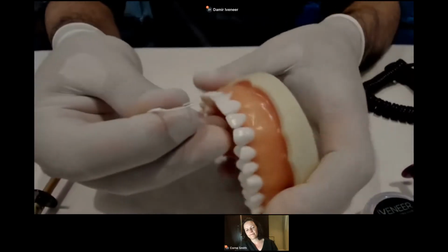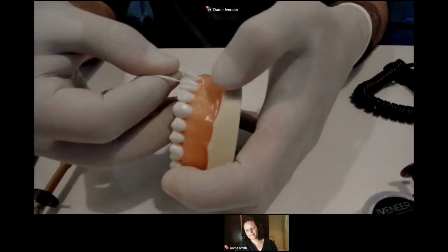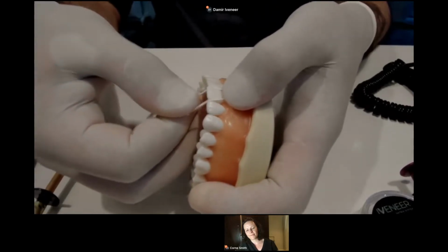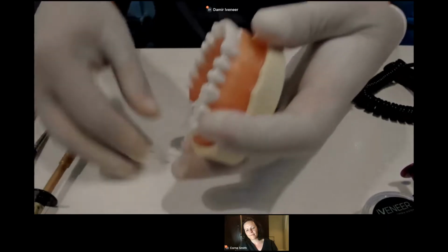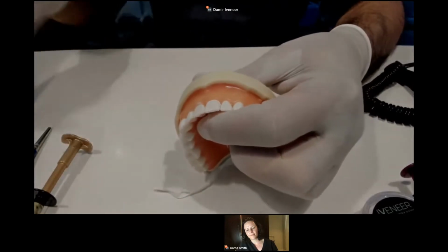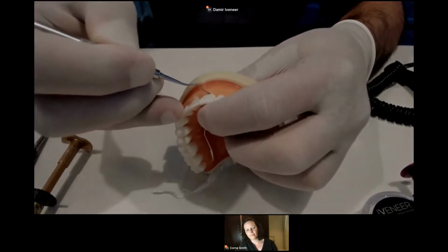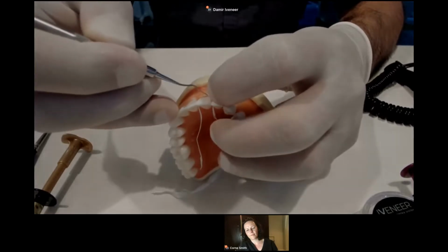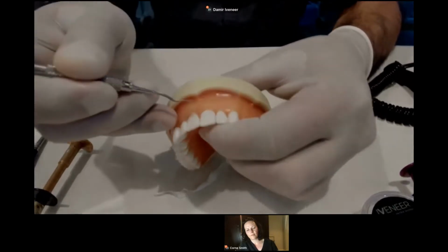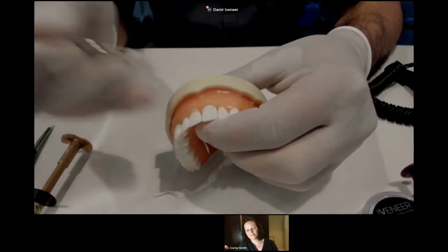I take this Teflon, and with my thumb, I put it here. I touch the Teflon with my thumb and hold it on the gums. And with my next thumb, I just push it inside. While I do it, I'm holding with my finger, creating a little bit of pressure, holding it, and then pushing it under the gums, very gently. Because this is a model, it doesn't go all the way down, but I create a little bit of pressure and then I push it. Okay, this is the thing. And I release a little bit. So this is my technique.